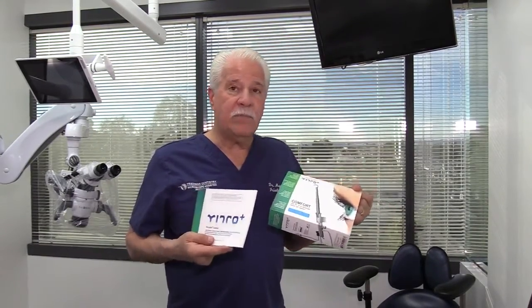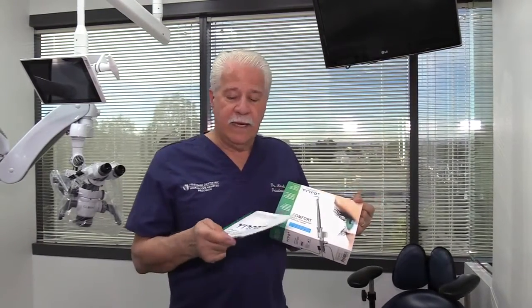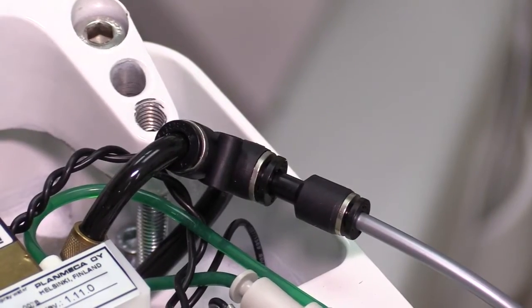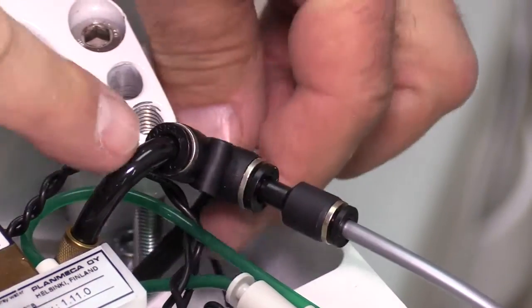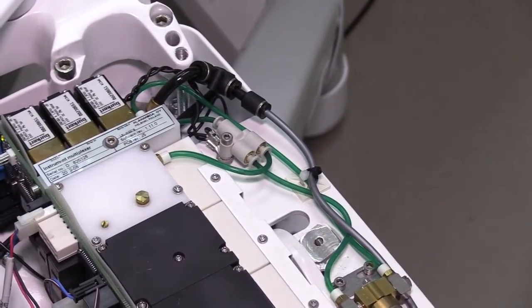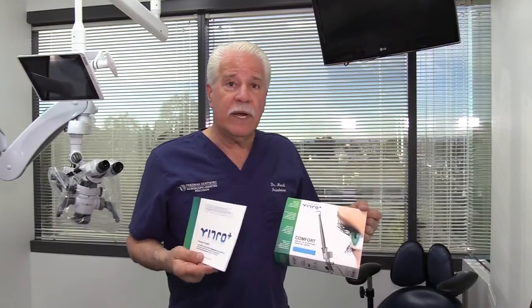We've just installed it in our Planmeca compact i unit and it took about 10 minutes to do that — cut into the air line that goes under the doctor's side, run a small spaghetti tube. They even have a Planmeca hanger and they've got other adaptations for other units as well.